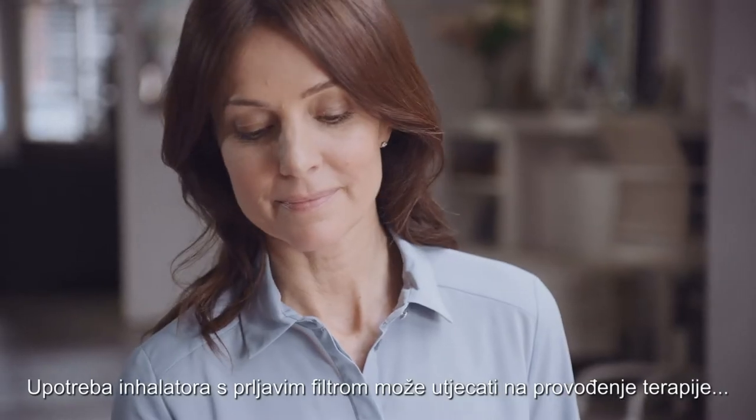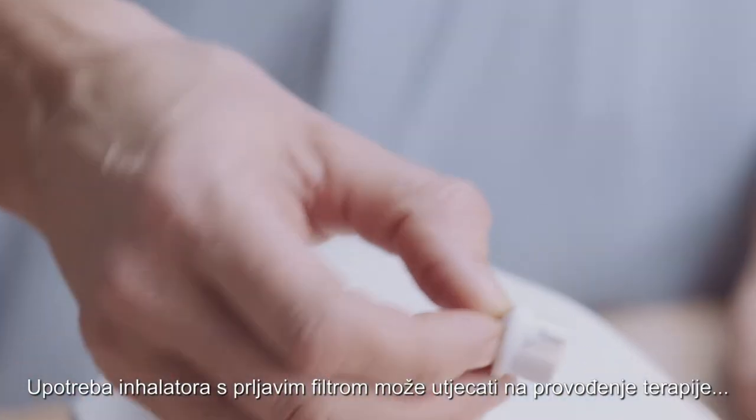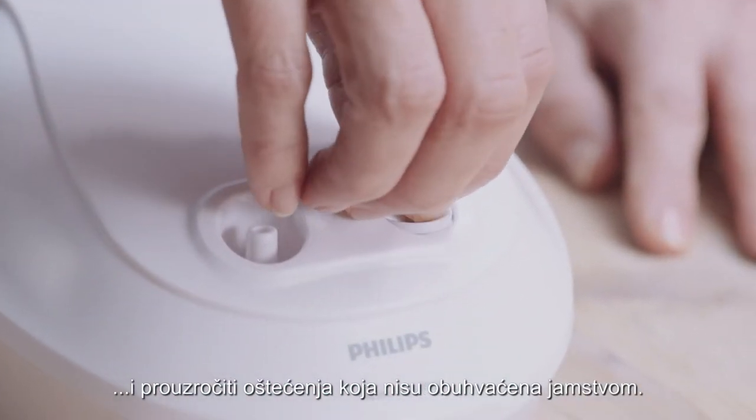Operating the unit with a dirty filter can impair proper operation and cause damage that's not covered by the warranty.